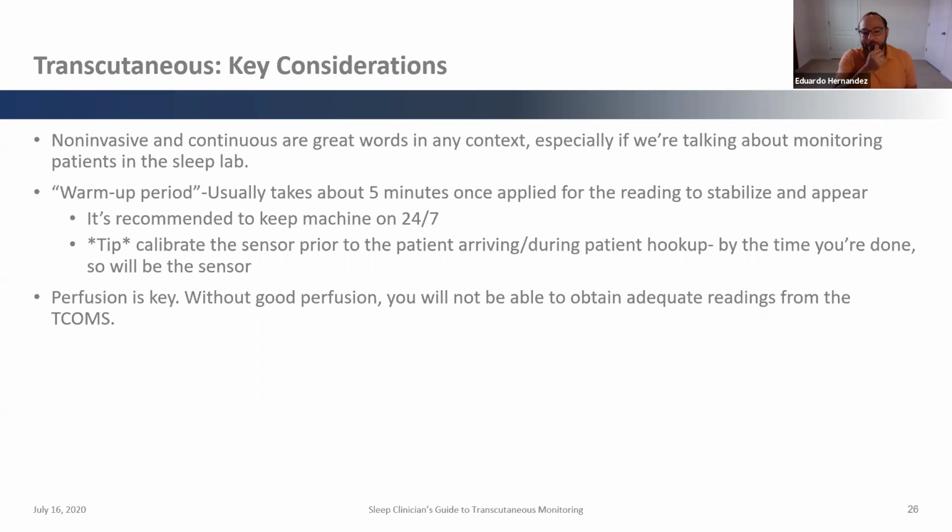Now, keep in mind, there is a warm-up period. It usually takes about 5 minutes once you apply the sensor to the patient for it to start reading and stabilizing. Many times, the way to get around this is before the patient comes in, try to do a last-minute calibration, or right when the patient comes in, do a calibration.